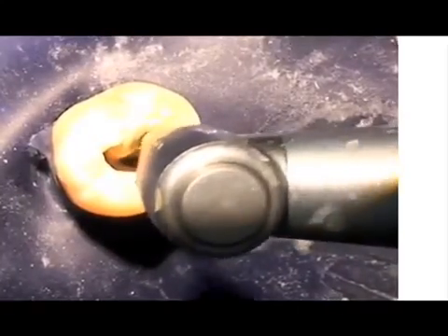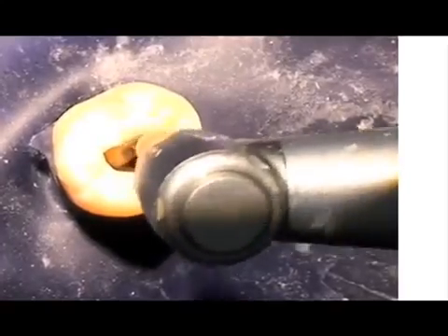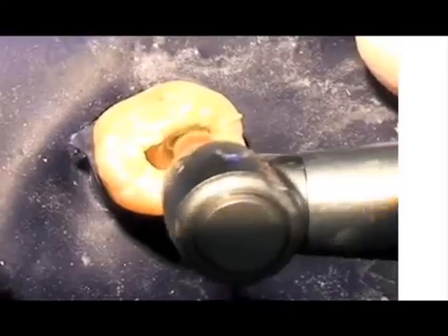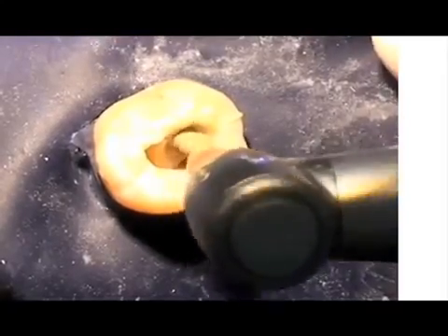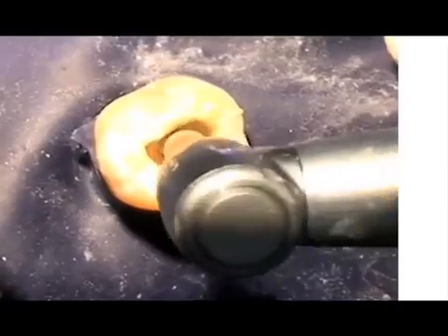The spiral is fully loaded and introduced 3 millimeters short of length. Several up and down strokes are used as it rotates clockwise. Each canal gets 2 full loads of cement, each applied with 6 to 7 vertical strokes. You may note that the pulp chamber is flooded with cement. This is usually no problem, and the excess cement in the chamber acts as a well of cement.